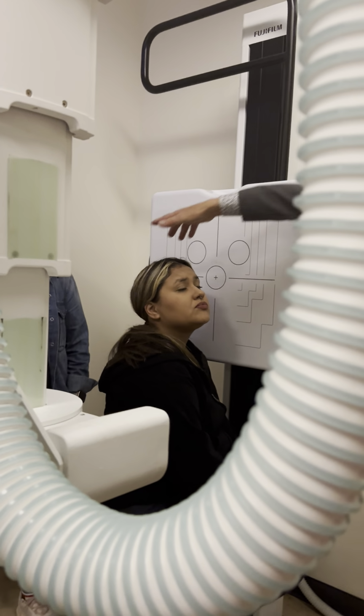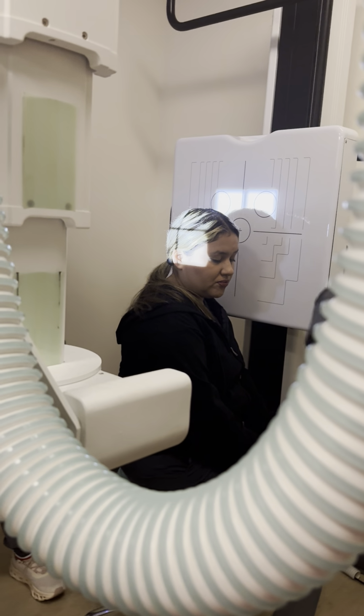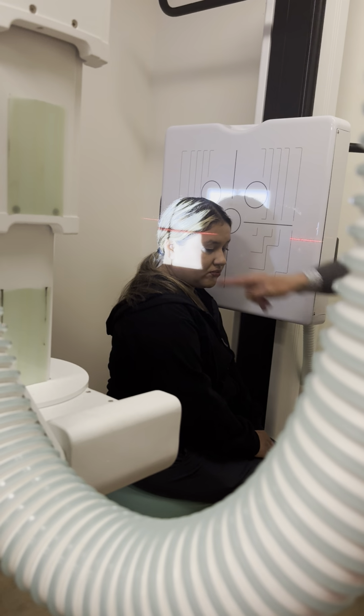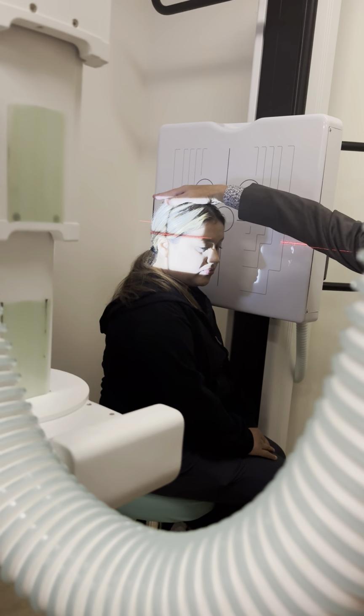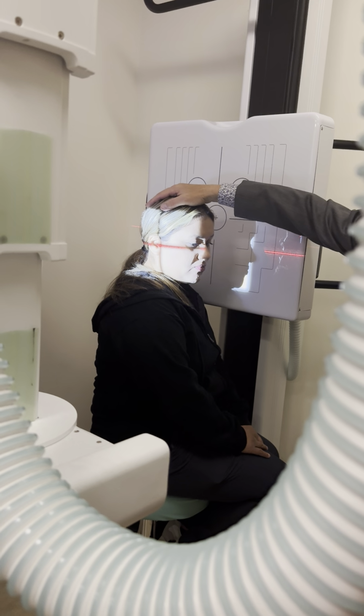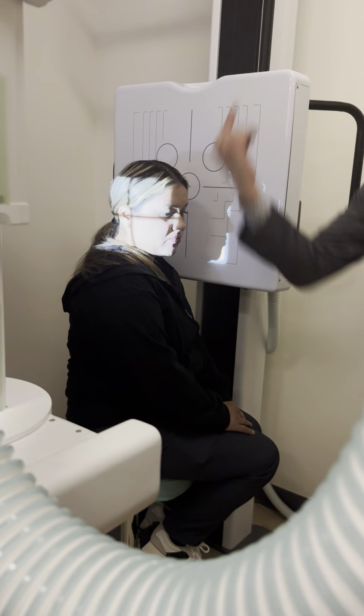I'm trying to actually show you, go ahead and tuck your chin down again for me, that if we bring the central ray, go ahead and bring the light down. Turn the red light on, to the bottom of the ear hole. Go ahead and do that for me. Yeah, 1 inch. Sorry. Keep coming down. It's okay, you're doing great. And I set it up such that the infraorbital meatal line is set up. Then I can come straight up 2 inches.